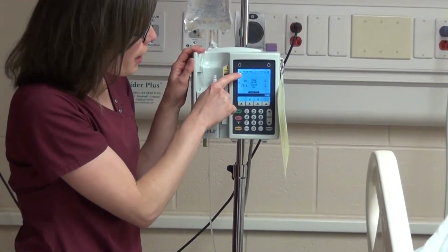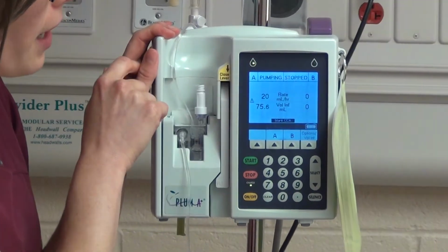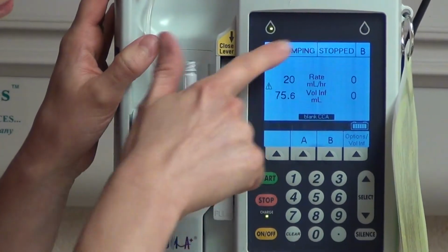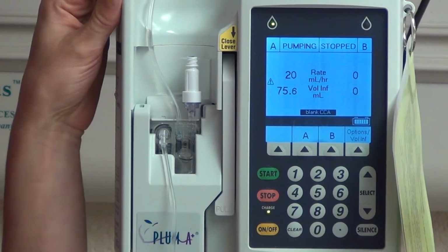And you can see the letter A here and the letter B. A would be for a primary, and it says that it's pumping and the light is flashing, so you know that your primary is infusing. When you look at the screen here, you can see the word rate and volume infused. Your rate is how fast it's going into the patient.